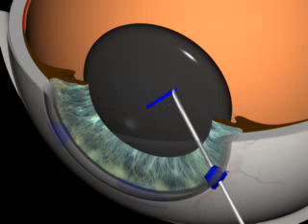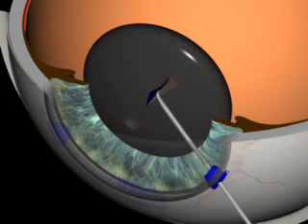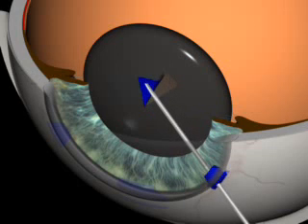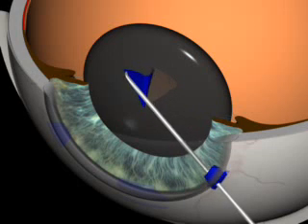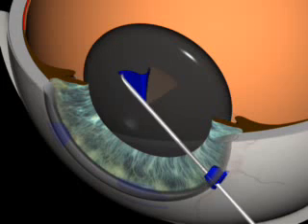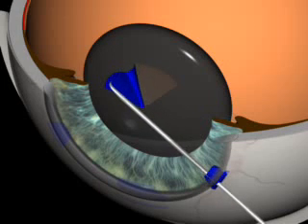The capsular flap is pulled and lifted at its edge. The flap is then inverted and the rhexis torn circularly until completed.